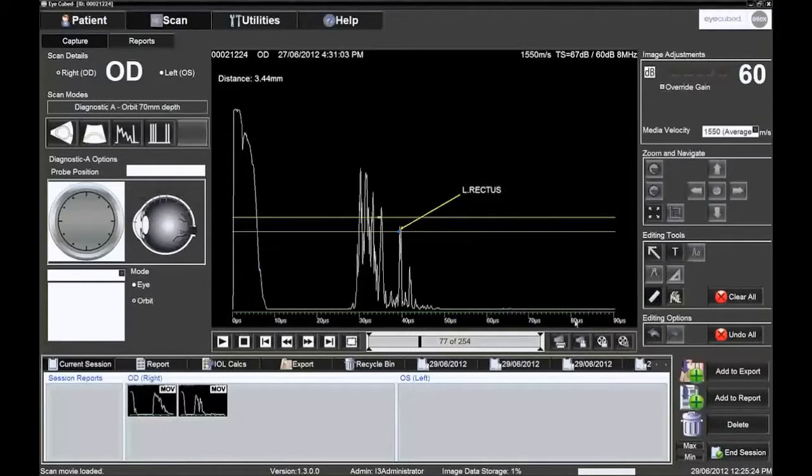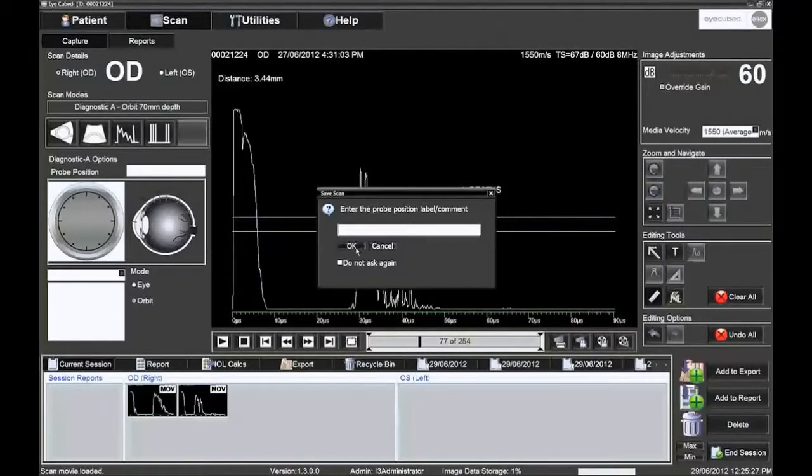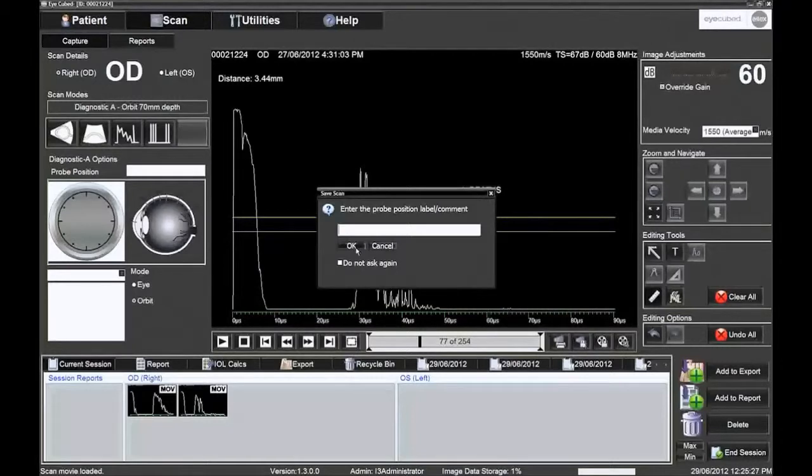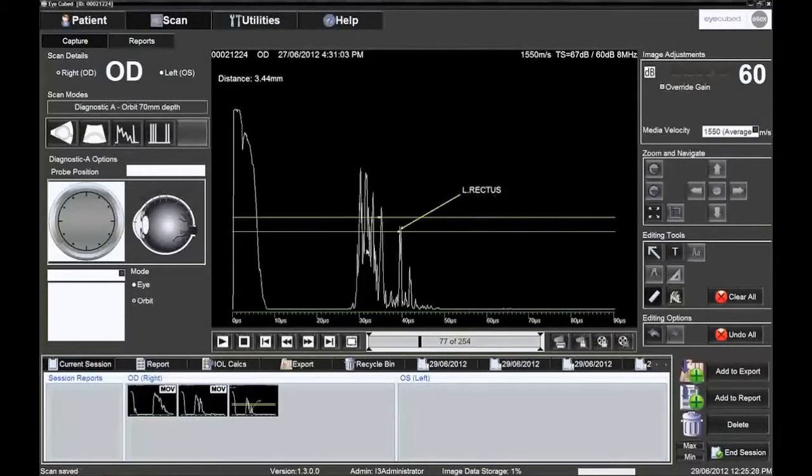To save an image, the operator simply clicks on the second icon at the bottom right below the A scan screen, or by depressing the right foot switch. The probe position can be entered at this point, either by clicking on the appropriate icons or typed in manually. The image that has been saved goes into the image tray for the eye being examined.